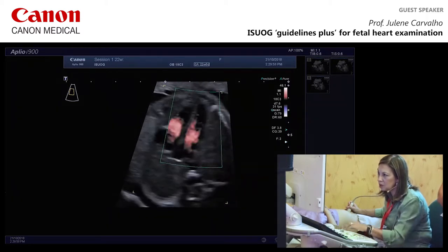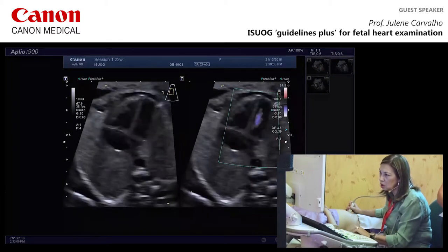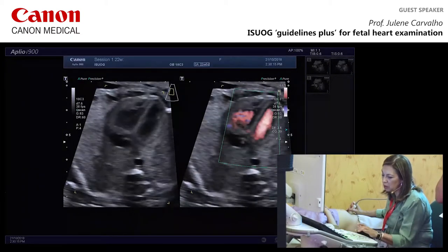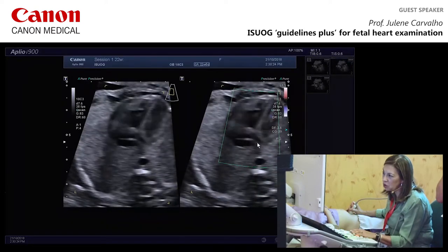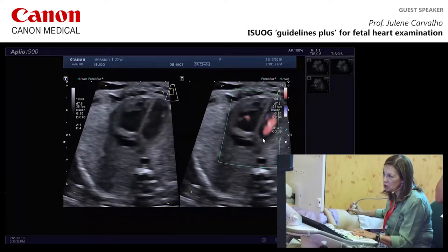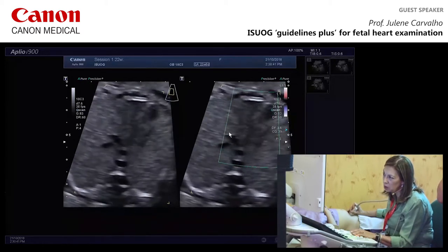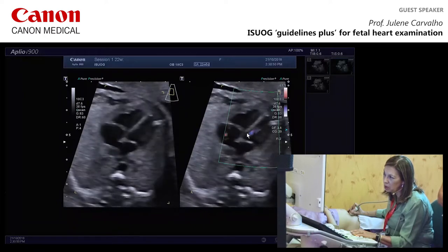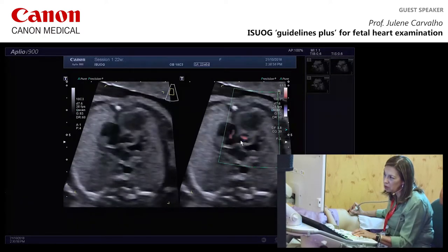Using a different color mode — ADF (Angio Doppler Flow), sensitive to lower velocities — with a split image display is very good for sweeping from the posterior heart. Here is the coronary sinus opening into the right atrium, draining the coronary veins back into the right atrium. Moving anteriorly: there's the mitral valve with normal offset, and this is very useful for doing a sweep of the posterior ventricular septum — no ventricular septal defect at the back of the heart.